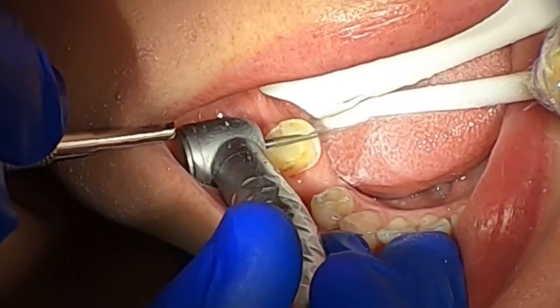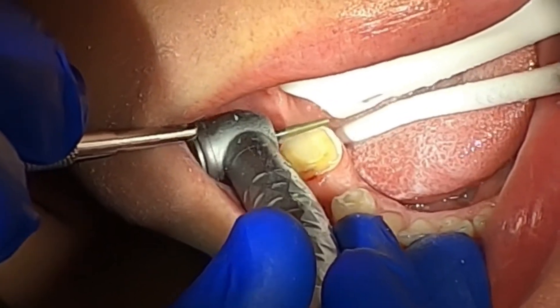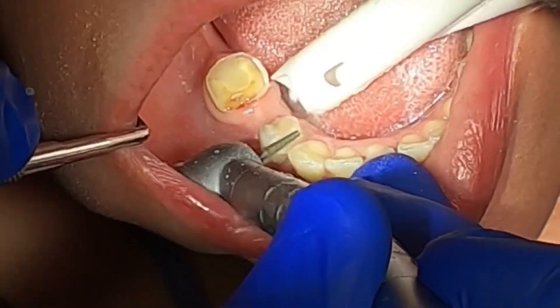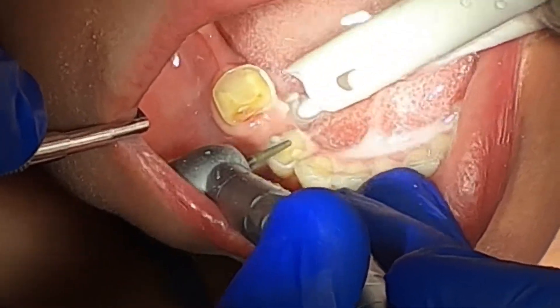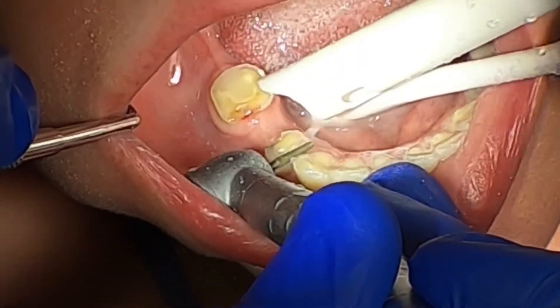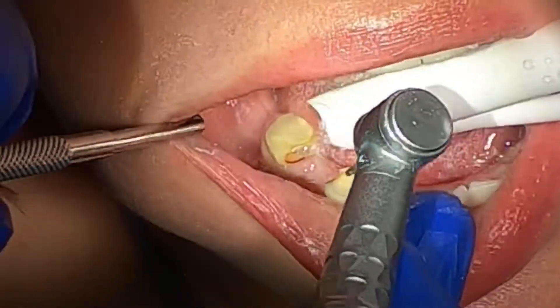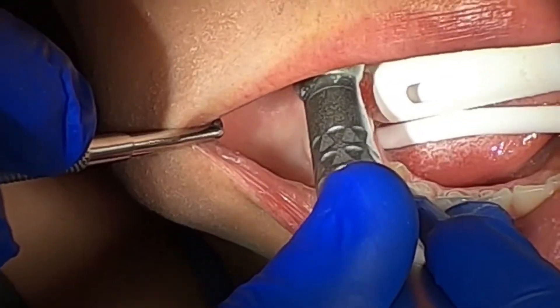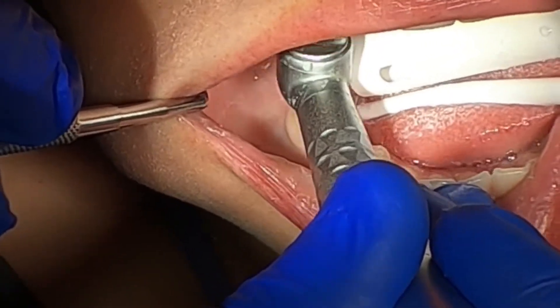Generally I think it's a good video. The total elapsed time on the preparation is roughly 10 minutes. There are some edits — little transitions with fades where I had to change a burr or refill the distilled water bottle. I usually tell my patients that each tooth preparation for a crown, assuming a normal situation, takes about five minutes, though sometimes longer — upper second molars can be difficult to access, and lower posterior teeth can also be a challenge.